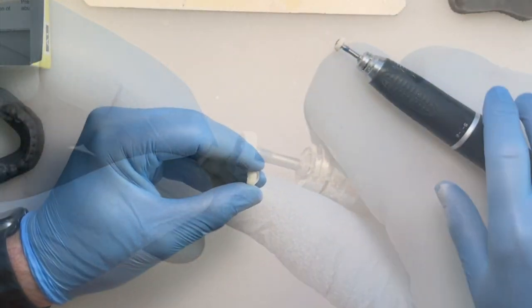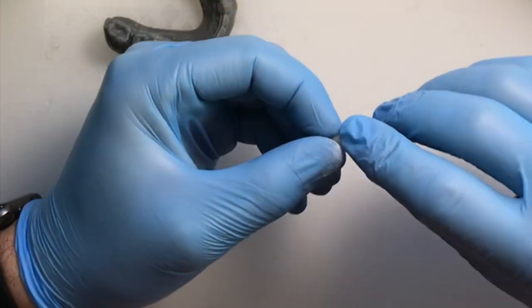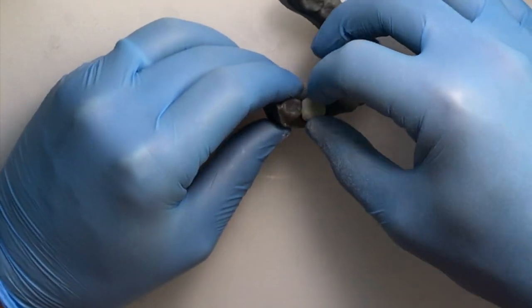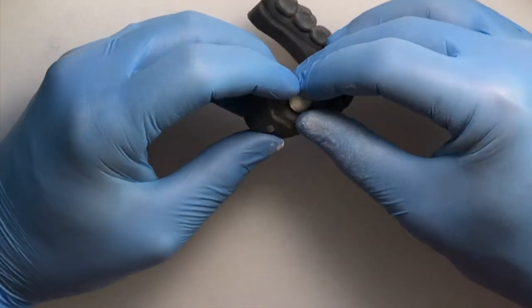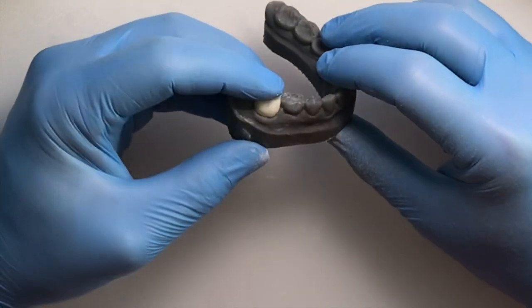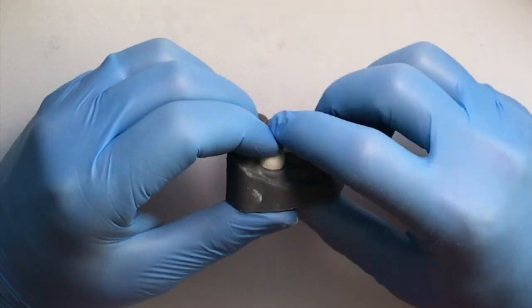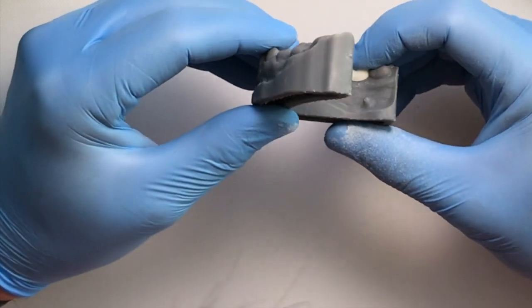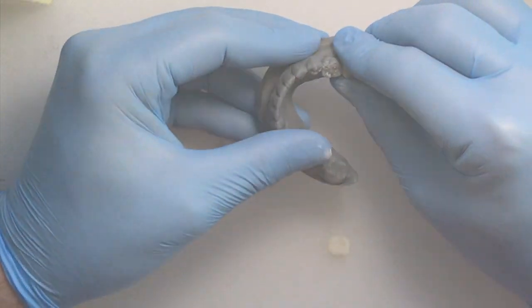Once you've got that completed, I will always marginate my crowns. First, I'll check it just to verify that I've seated it all the way, that we're close to a good replica of what a provisional should look like.